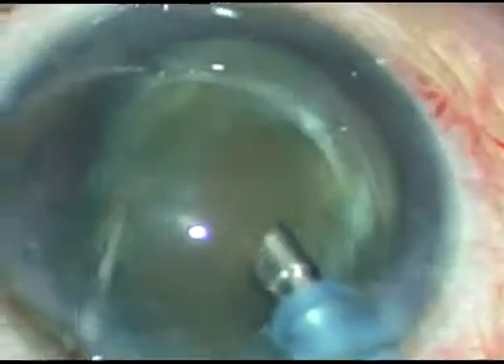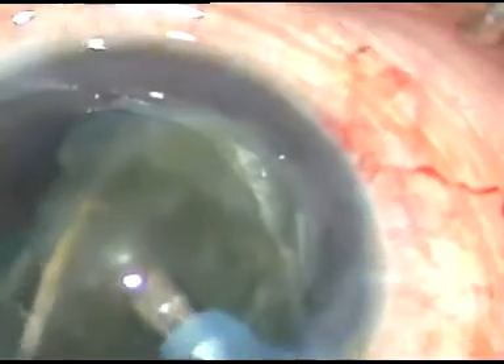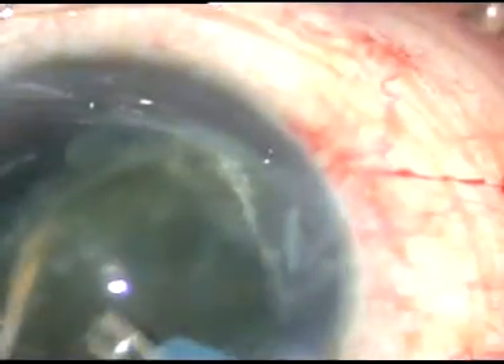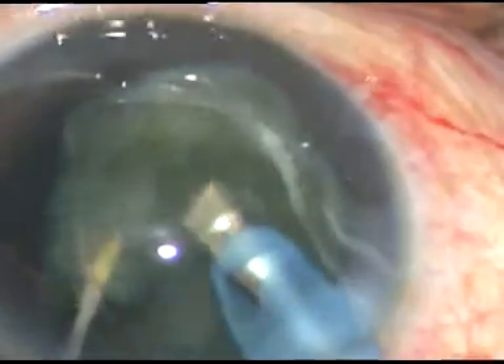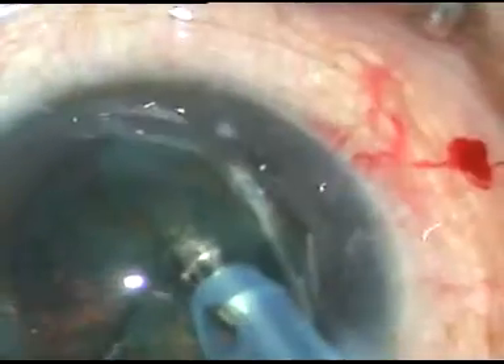See how I do it: one sculpt, two sculpt, three sculpt — and the portion which is above the capsule, the supracapsular portion of the nucleus, has come up. Now I am dividing this part into two parts, and each part is being emulsified and removed.